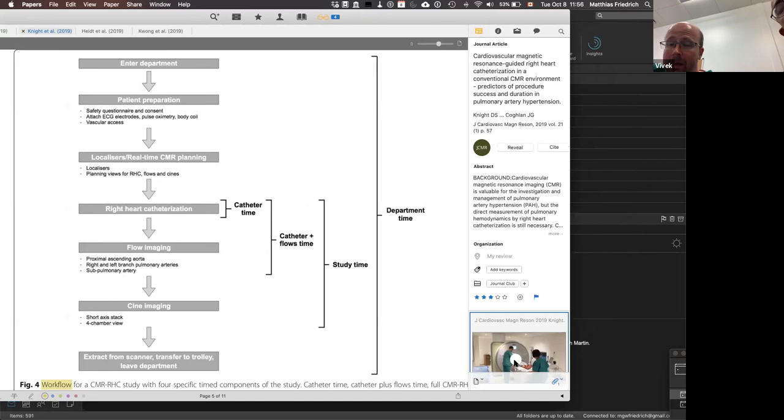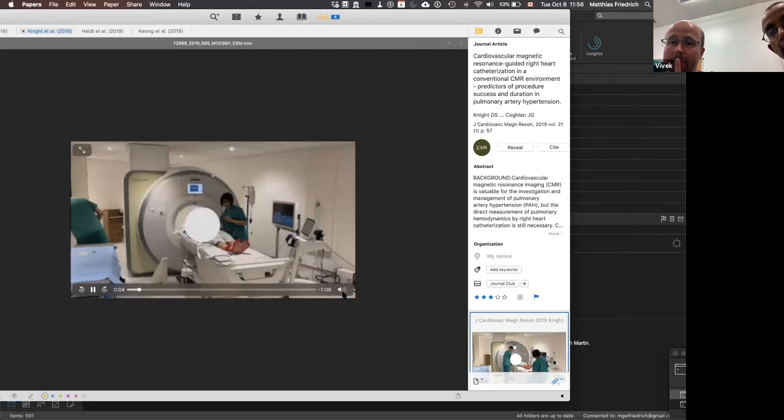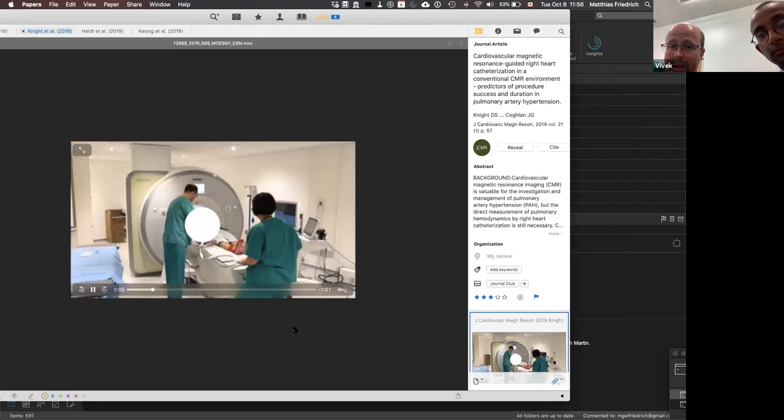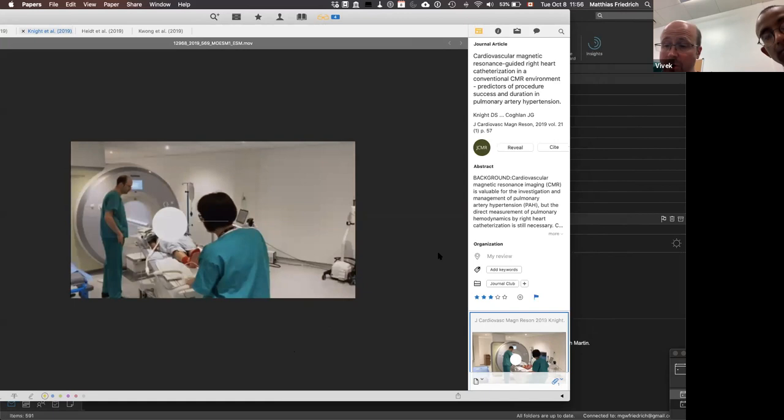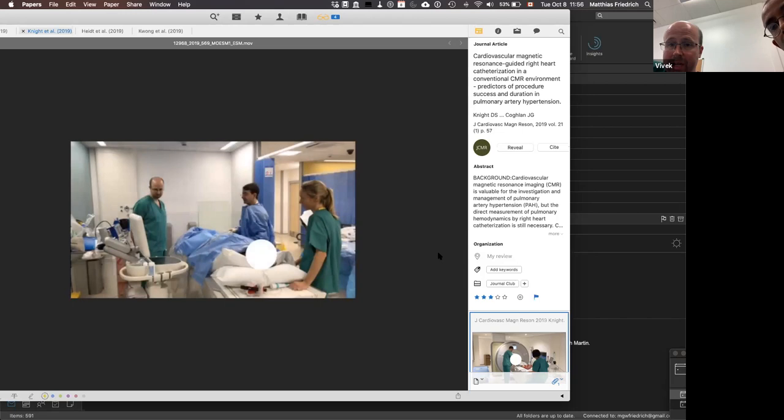So here you can see it. If you just fast forward that very first little bit, that's us just getting the patient ready on the table as described. And then you'll see we just head outside to pop the sheath in. So it's just a completely conventional environment. That is just an MR-compatible patient trolley there, which we use as our workbench for the catheter case. So as you can see there, we bring them outside the scanner. So it means you can have an ultrasound if you need it. You've got the arrest trolley if you did need it for whatever reason, although that shouldn't be an issue. And it's just a more controlled environment out of the scanner.